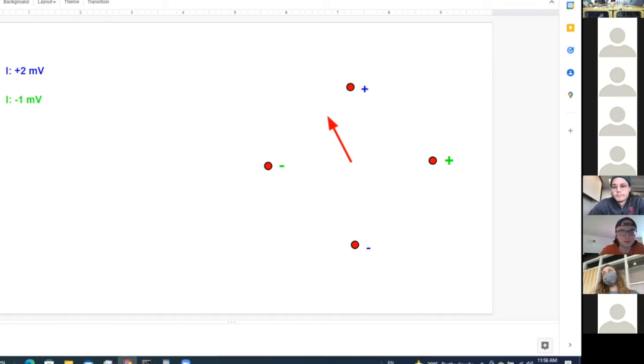And this vector cardiogram, or VCG, is still used mostly as a research tool or in clinical studies related to research. For whatever reason, it has always had more of a following in Europe than in North America. So if you do a literature search on vector cardiogram or VCG, the majority of hits you'll get will probably be from European labs. It's like all things, right? The fashion is different here from Europe. Lots of things are different. Cars are different. So it's ECG. Why not? Got it.